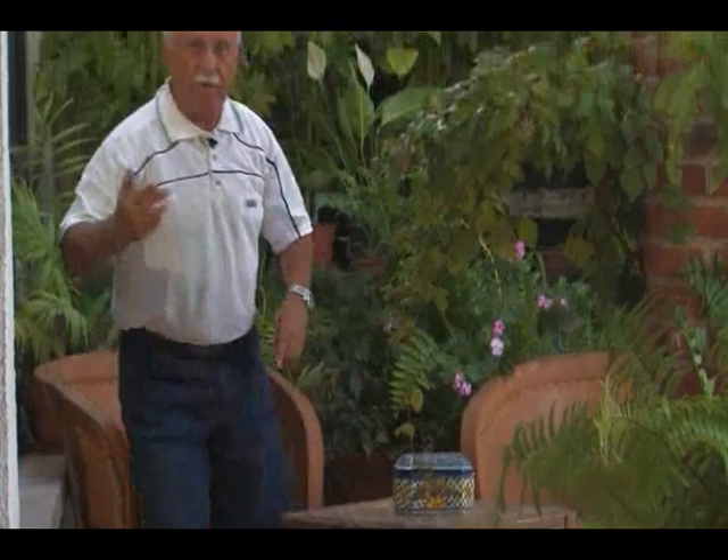Hola amigos, en el tip anterior vimos como derramar el hierro fuera del lechón. Recuerdan, ahora veremos como hacerlo correctamente de varias formas. Vamos, me acompañan.